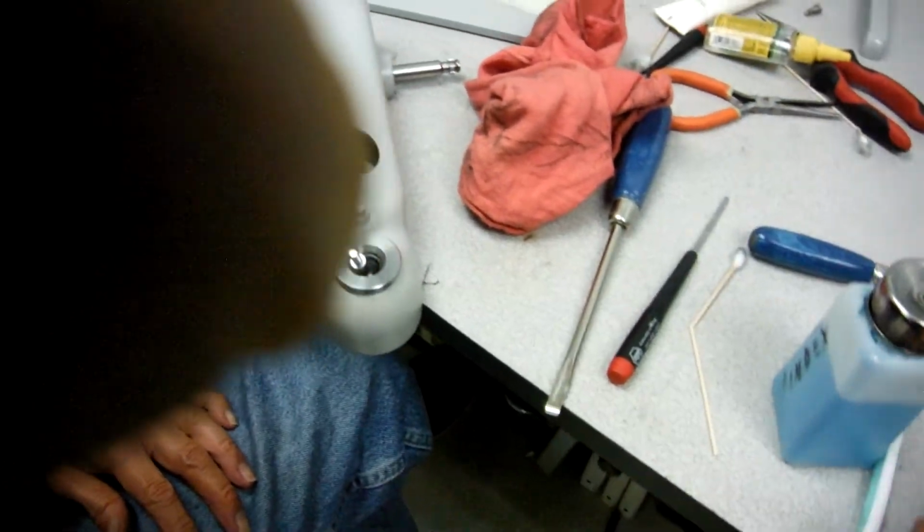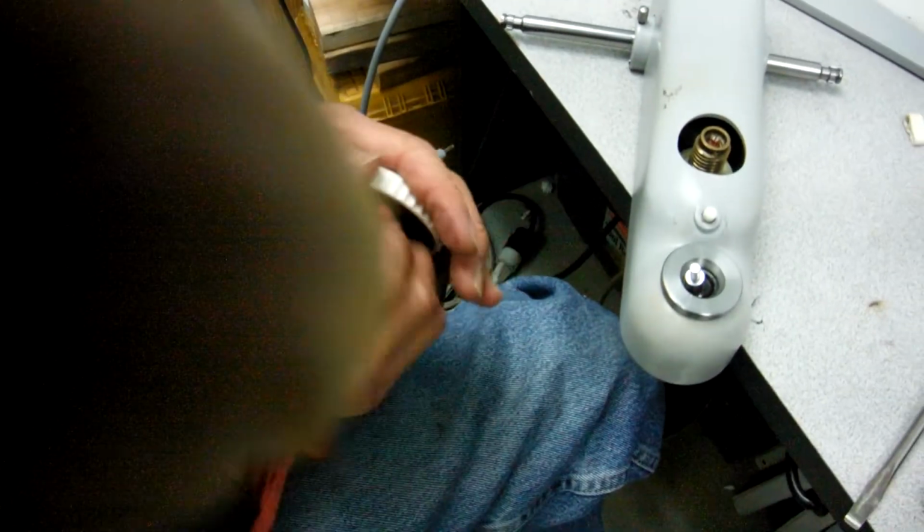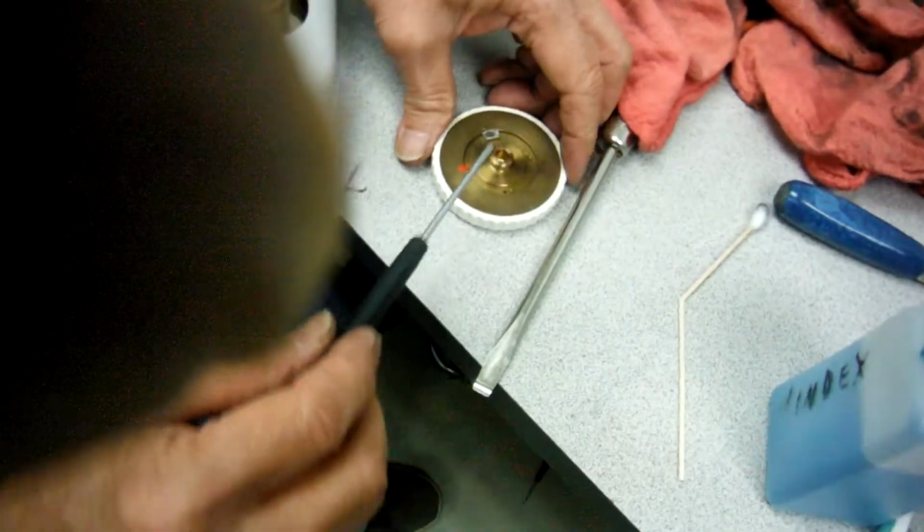All right, now in order to put your elevation knob back in place, okay, a lot of times you might not need this one.